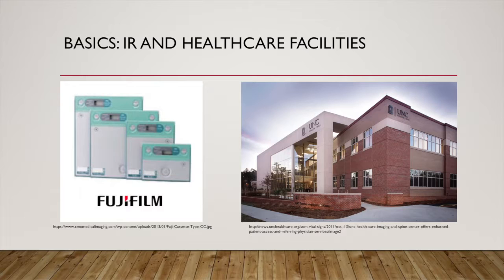contrast. However, scoliosis is a fairly common pathology in which the spine may be curvy, so you'll have to keep that in mind when collimating in order to not clip off any pertinent anatomy, such as the spine itself. If you're trying to visualize a certain joint, such as the lumbosacral joint, a 10 by 12 inch IR in lengthwise position with open collimation to include the SI joints as well would be appropriate.